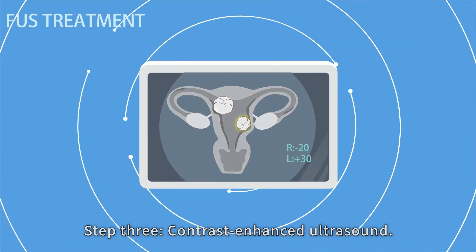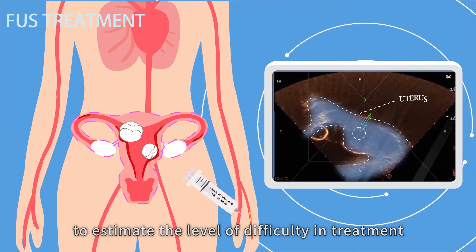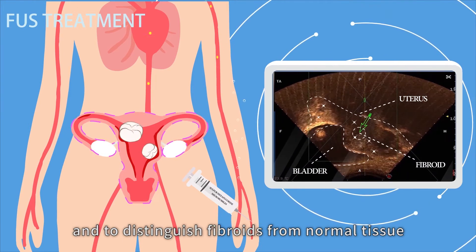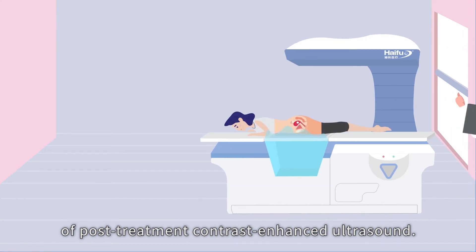Step three: contrast-enhanced ultrasound. Contrast agents are injected to determine blood perfusion, to estimate the level of difficulty in treatment, and to distinguish fibroids from normal tissue for comparison with the result of post-treatment contrast-enhanced ultrasound.